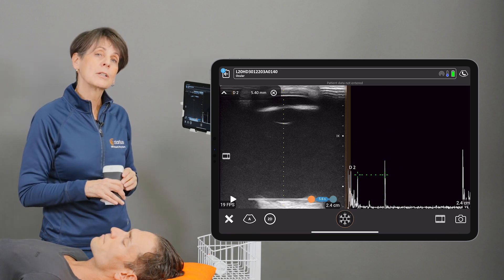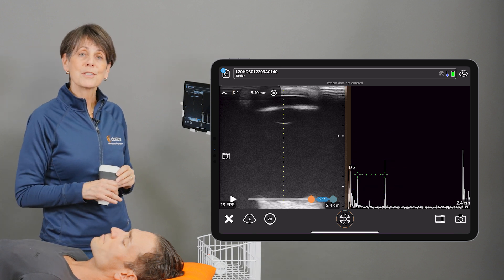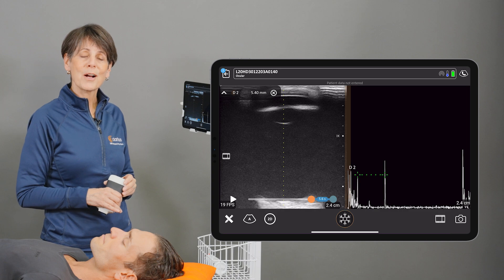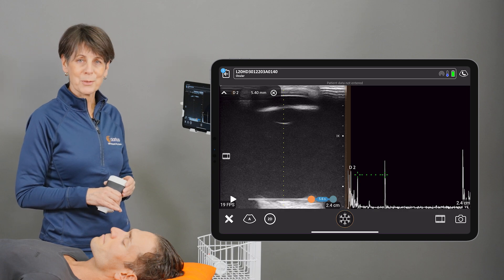So there you have it. Clarius offers a complete solution for ophthalmic ultrasound.